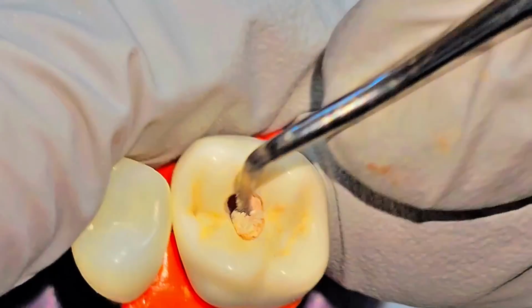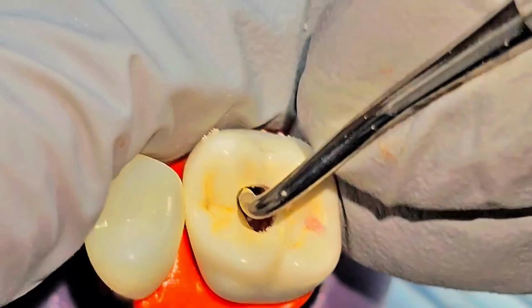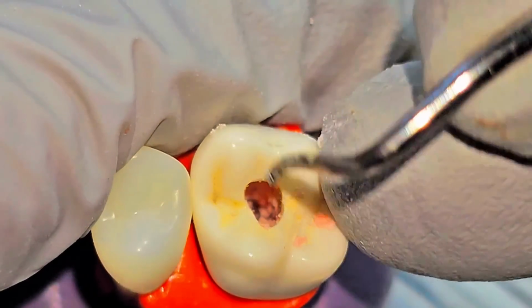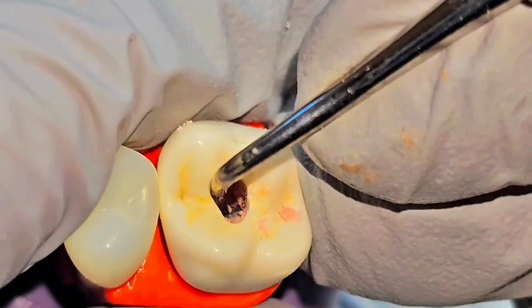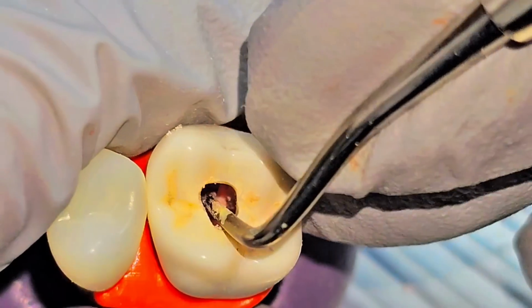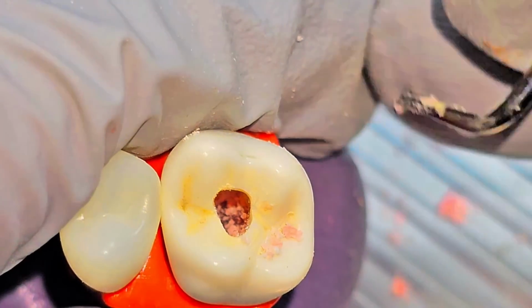You need to remove all the pulp tissues in the chamber, and as you use the explorer, you feel whether there are some unremoved pulp horns or roof of the pulp chamber.